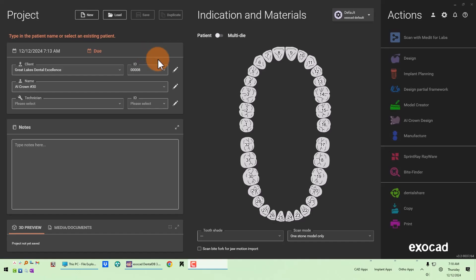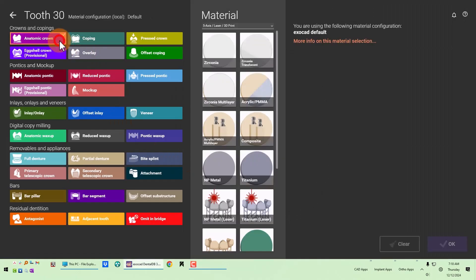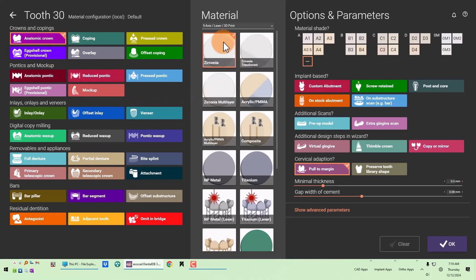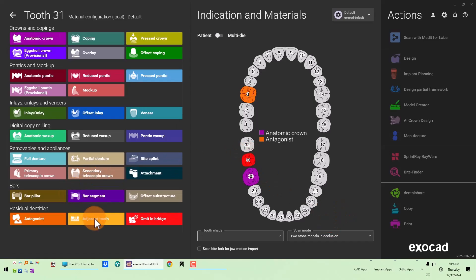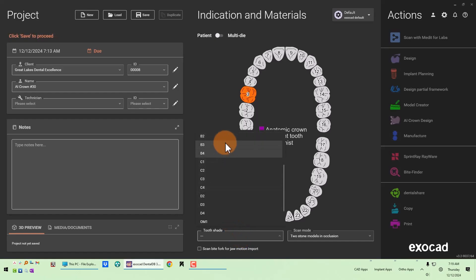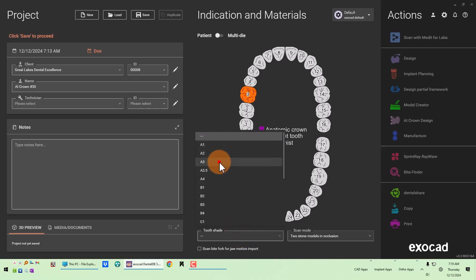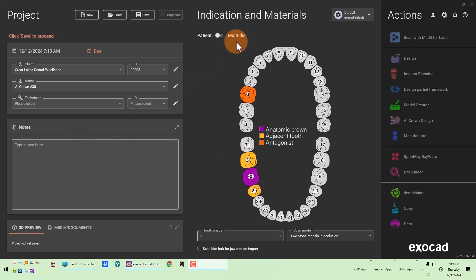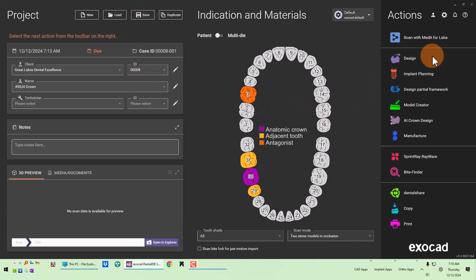For our first example we're going to do a crown on tooth number 30. Just like a normal crown workflow, we're going to select the tooth, the material, and our options and parameters. I'm going to define the neighboring teeth and set a shade for the job. Now instead of going forward with design, I'm going to do AI crown design.